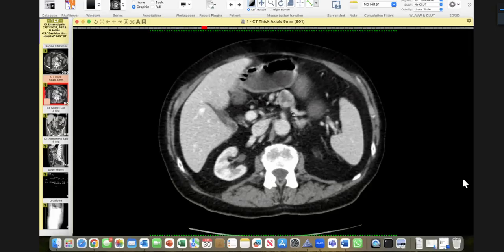And again, in your description, what you did was that you described it and you started describing it once again and once again. Fat planes, stomach. Even in your conclusion, you should have been emphatic. It is a neuroendocrine tumor, extrapancreatic neuroendocrine tumor, and my differential is this, this, this.